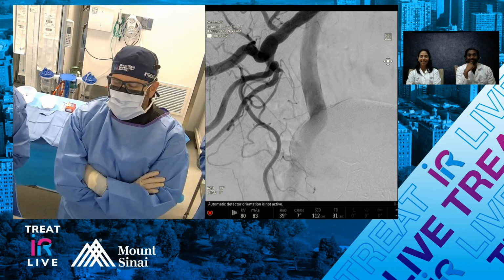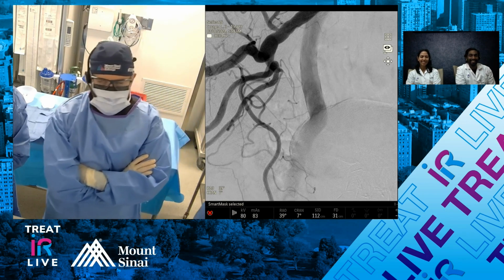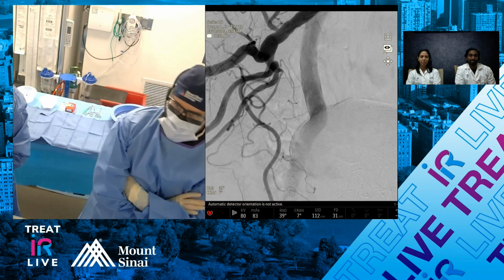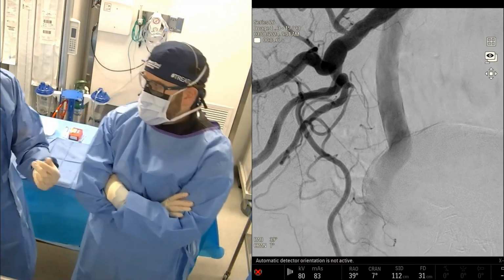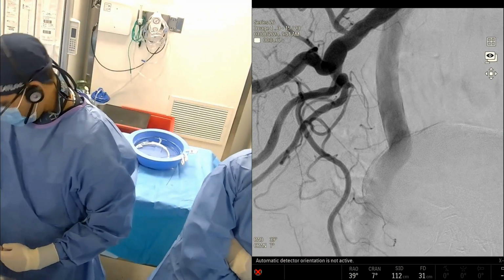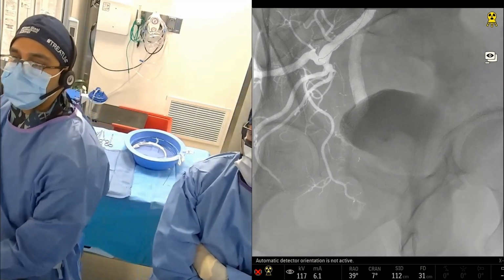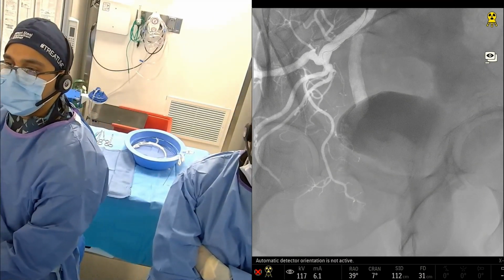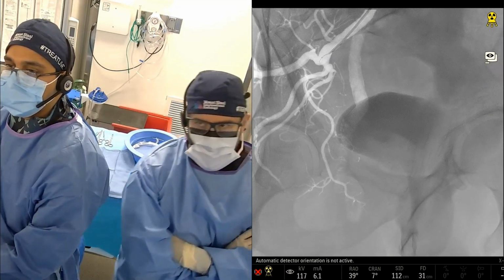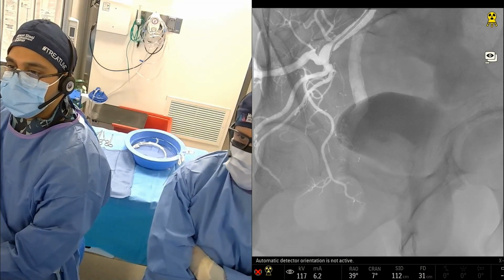Look, we all need to get published. We're going to have a 1A, 1B, 1C classification at some point. It's coming down the road. But the 1s can be challenging. And again, I think that comes back to what we were talking about with microcatheter selection, using something like an angled True Select. If you really have a challenging origin, especially starting out, use what you're comfortable with. The True Select is a 2 French, 2.8 to 2, and especially in tall patients, you're going to get 175 length out of it. But it's really what you're most comfortable with.